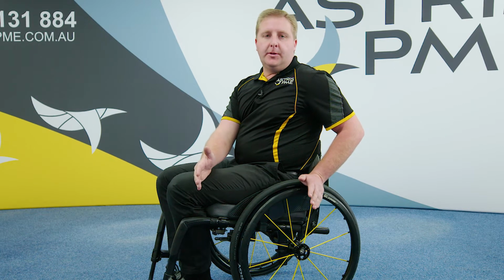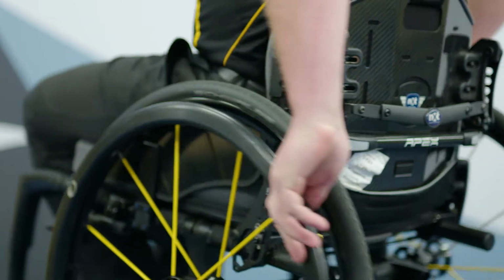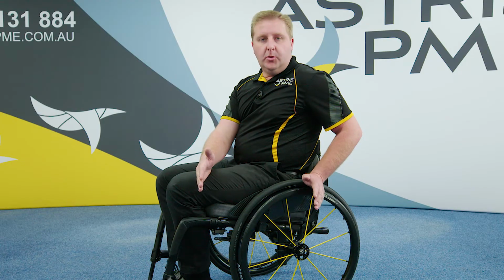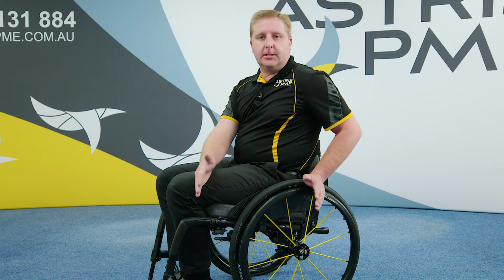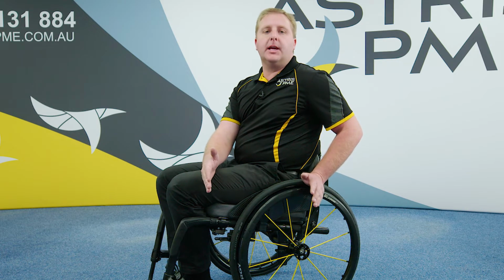This would be determined at time of scripting as to your client's needs, whether they're an active user or someone that may need a longer wheelbase for stability. Having a shorter wheelbase with your rear wheels and casters closer together means it's more manoeuvrable, it's a shorter frame to get around and easier to push. Some circumstances you might like to have it longer.